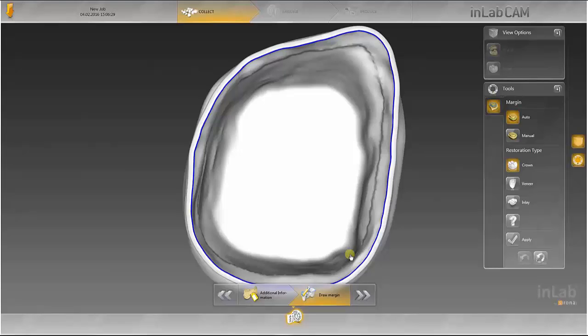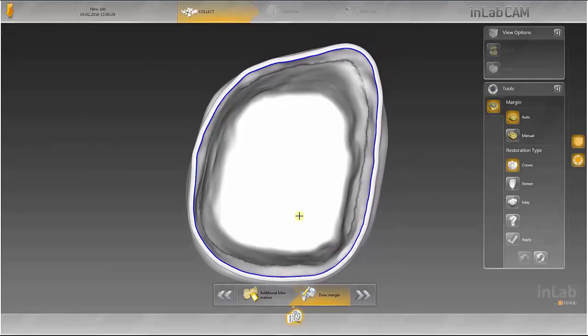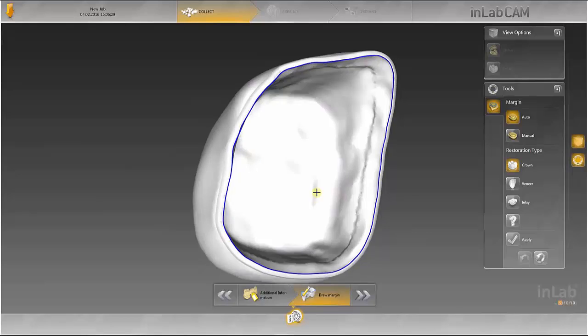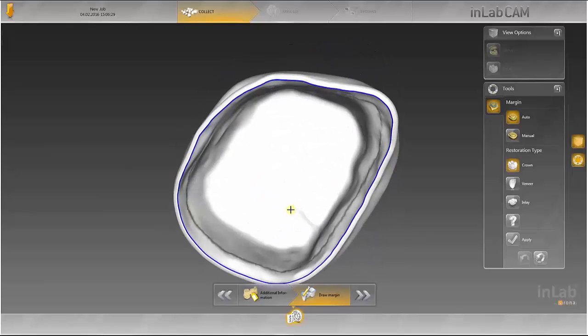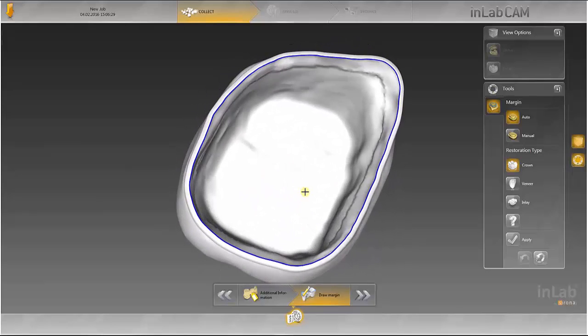The margin line is marked in the next step. Here too, the InLab CAM software provides a suggestion which you can check and adapt as necessary. By clicking Next, the dataset is added to the other restoration data.